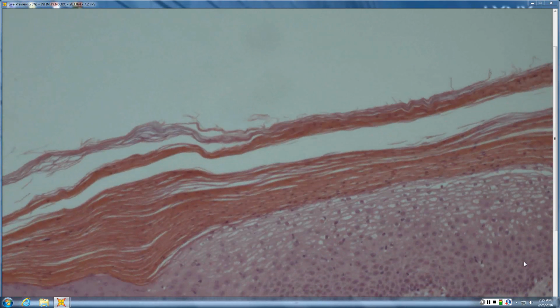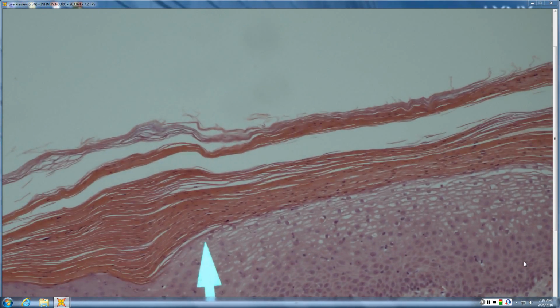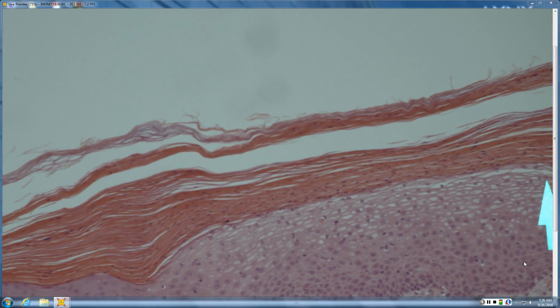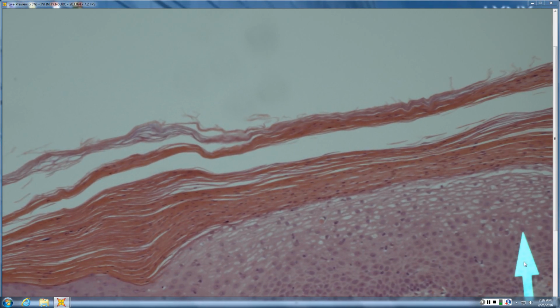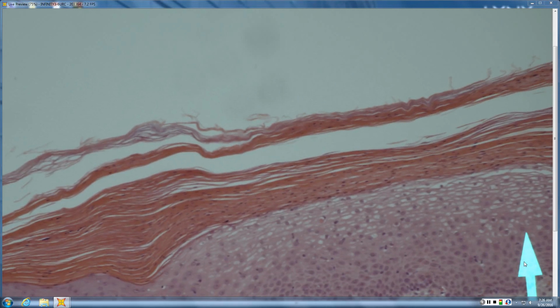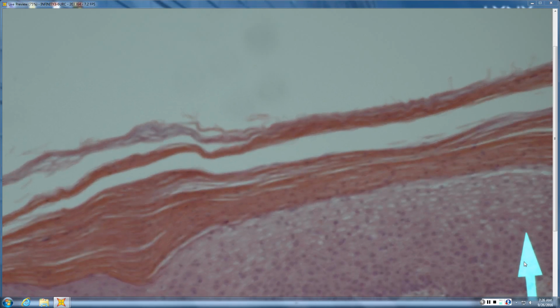And this is pretty good for it. It's never going to be as good as the textbooks, but in this case you do see basically para and ortho and para and ortho, and just ignore these neutrophils. So it's kind of this checkerboard pattern. You shouldn't see a whole lot of neutrophils in the stratum corneum because that would go more with psoriasis. You can see a little bit more spongiosis in PRP, whereas you typically don't see spongiosis in psoriasis. You can actually start to get acantholysis in PRP, and if you see that, that's actually pretty good for it.